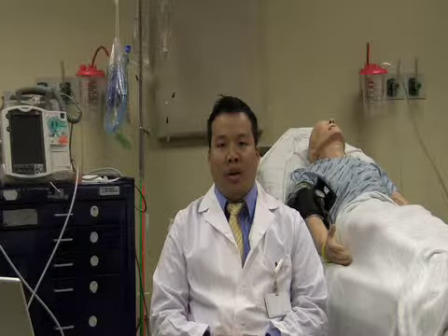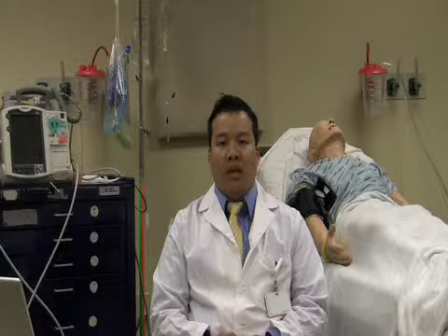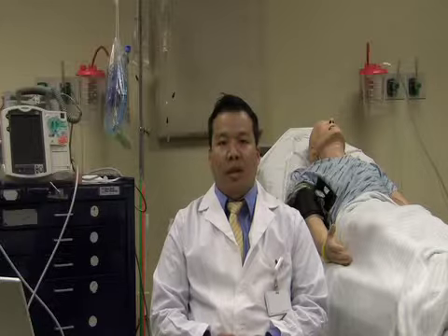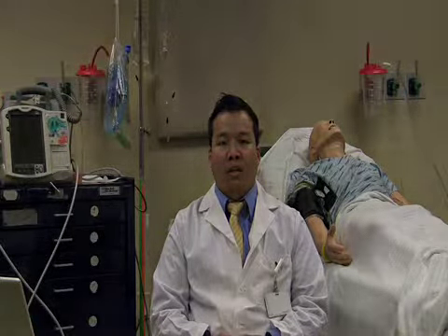Typically this may occur in patients when their heart rate drops below a specified rate, typically 50 to 60 beats per minute. When the heart does not deliver its own intrinsic electrical activity, the pacemaker is able to sense this and fires, initiating depolarization of the heart.